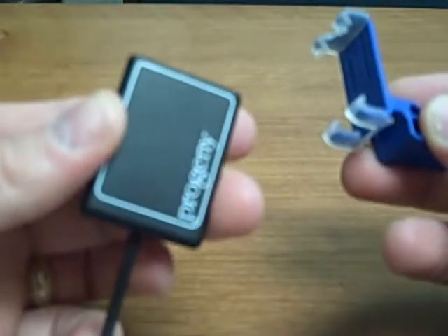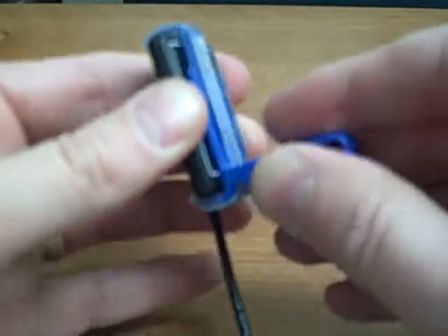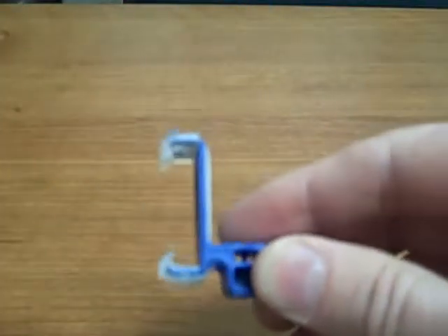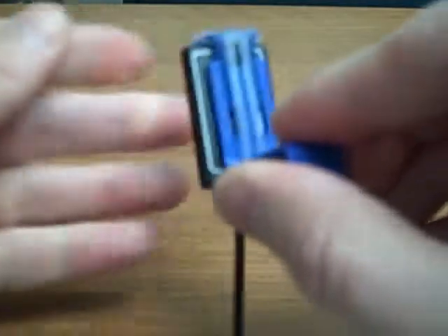Here we have the size 2 Progeny. You can see what that looks like front and back. Basically you just push the adjustable clip up with the edge of the sensor, and it's secured in the basket. This same bite block works with the size 1, and that's true for each of the indications.